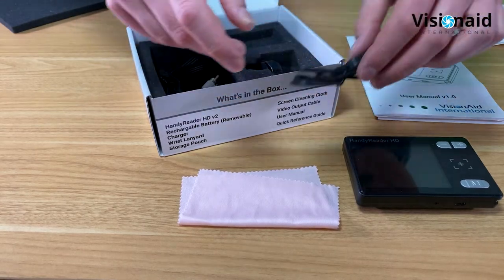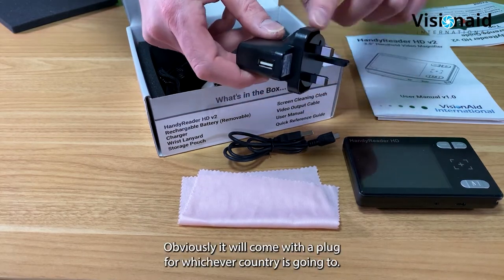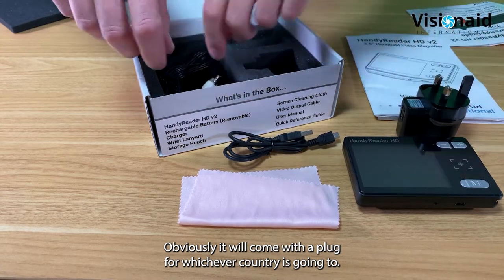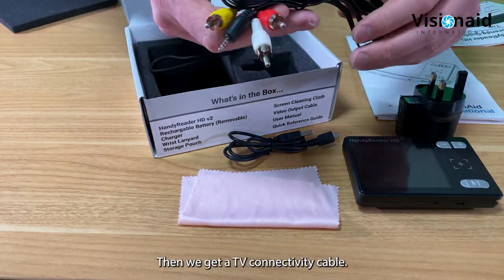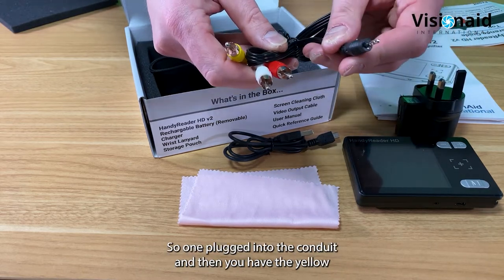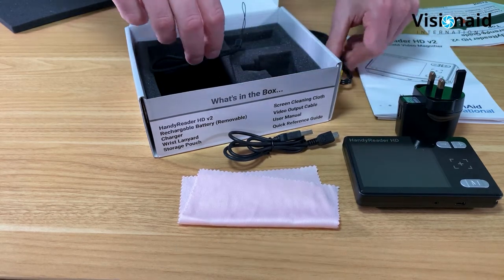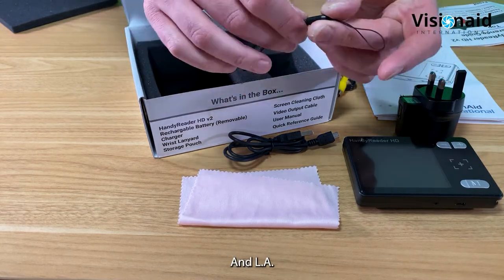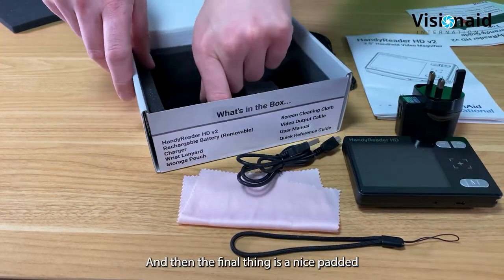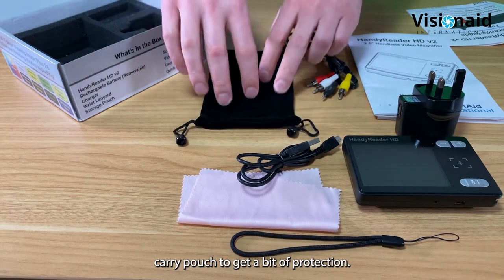Also included: a USB charging cable that plugs into the included USB charger with a plug for whichever country you're in, a TV connectivity cable with a yellow phono connection that goes into the TV (more on that later), and a lanyard to protect the unit if it slips from your hand.